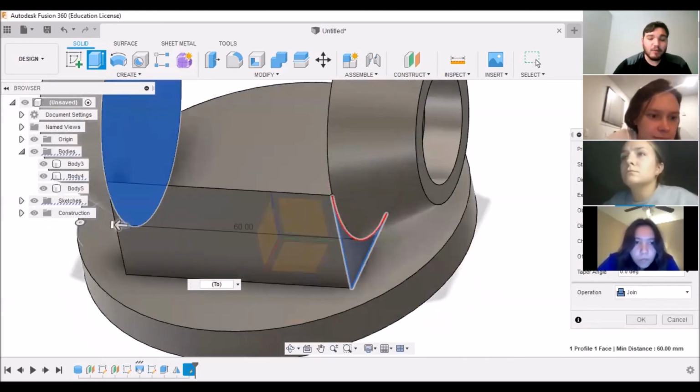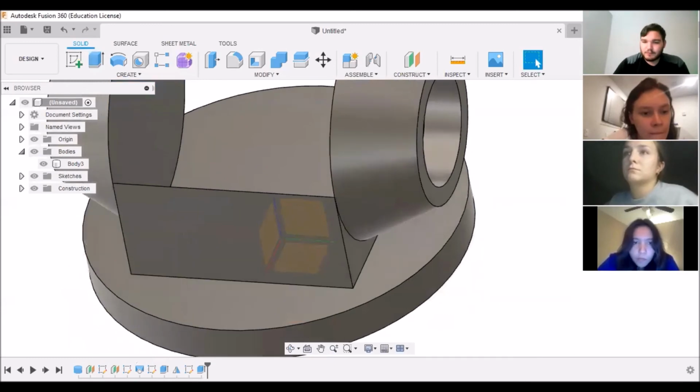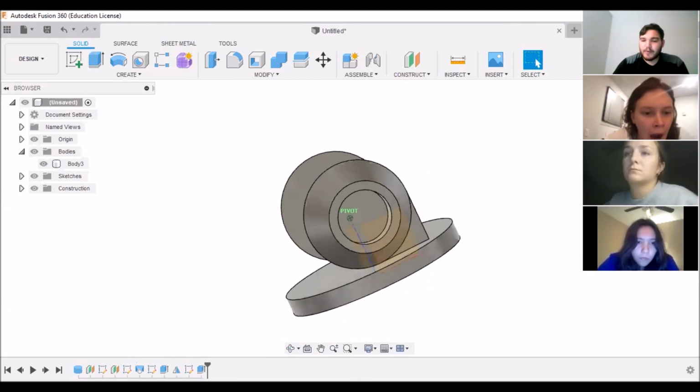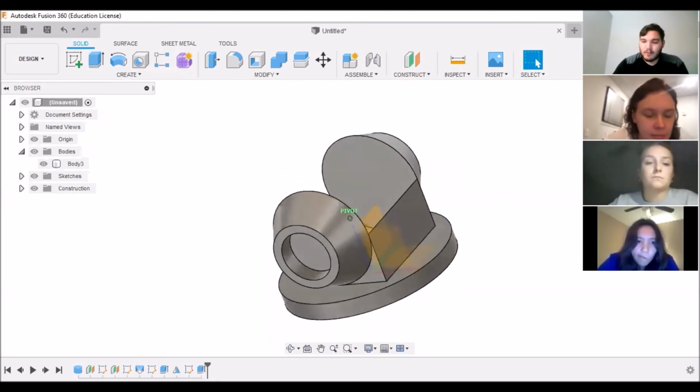If again, you need to go back and modify anything, it remembers that it's to that exact face and not to a specific distance. So no matter what happens, your geometry will stay the same. And our operation is join again, and we can press OK. So now we have a little rotating jaw. Everyone tracking along?